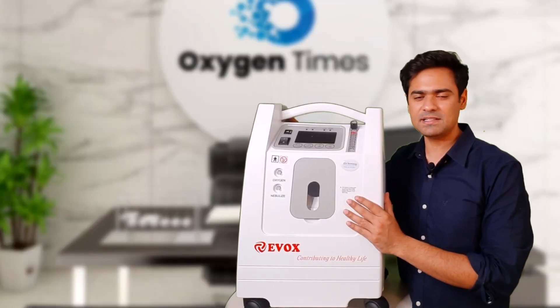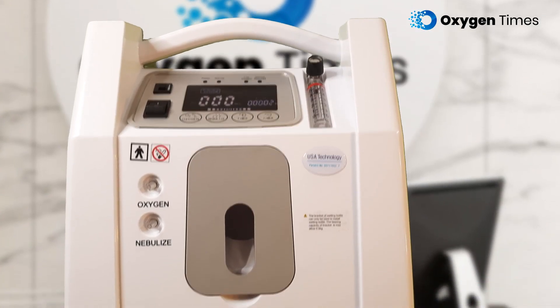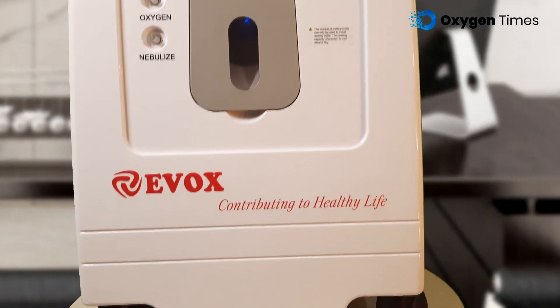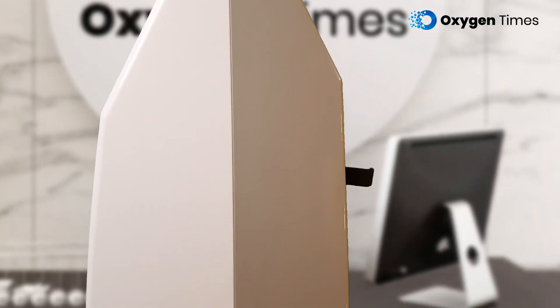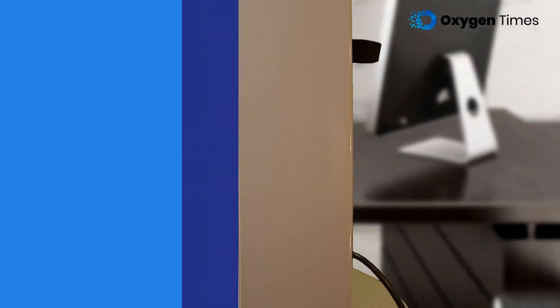Coming to the exterior, the quality of the body doesn't seem up to the mark. But I believe we can give Evox the benefit of the doubt here, considering they have loaded the machine with features in a very economical price range, targeting a price-sensitive market like India. They have probably invested more in features and compromised on the quality of the exterior just to bring the cost down.